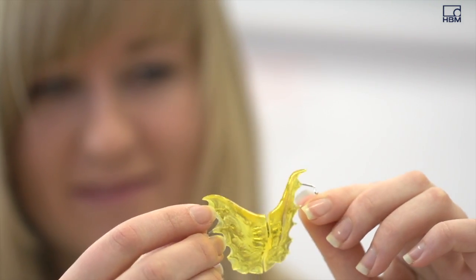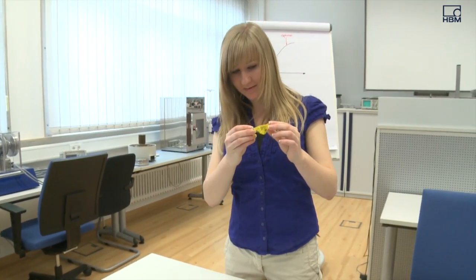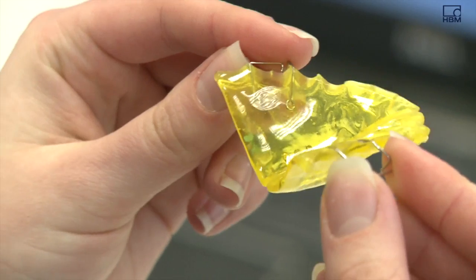Is it possible to shorten the time braces need to be worn? These were questions asked by Lynn Beesk, who is studying material science at Aachen Technical University and is working on developing sensor-based braces.